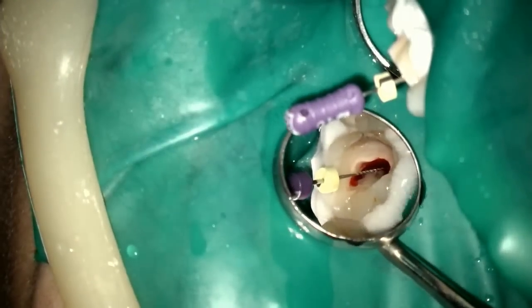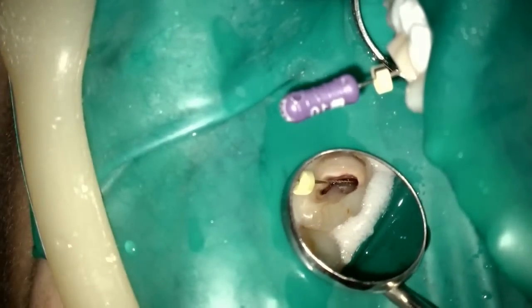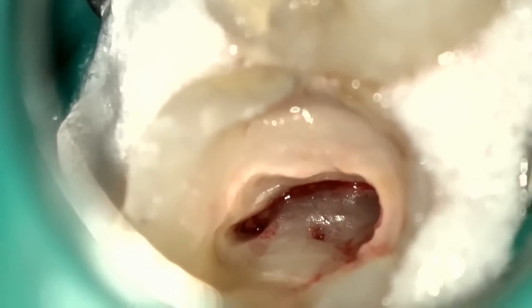The cavity has been basically outlined. I attempt to get working length with the apex locator. I don't make it a life-and-death situation that I have to work my way all the way down the canal at the very beginning of the case. If it gives it to me, I will get all the working length. If not, I'm not afraid to start instrumenting to get a little more straight-line access in the coronal third.